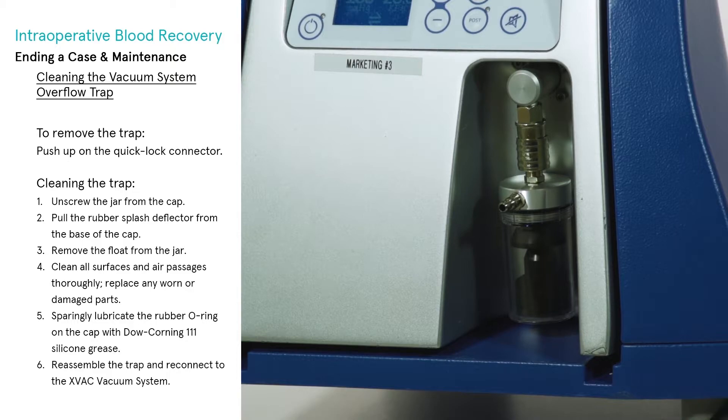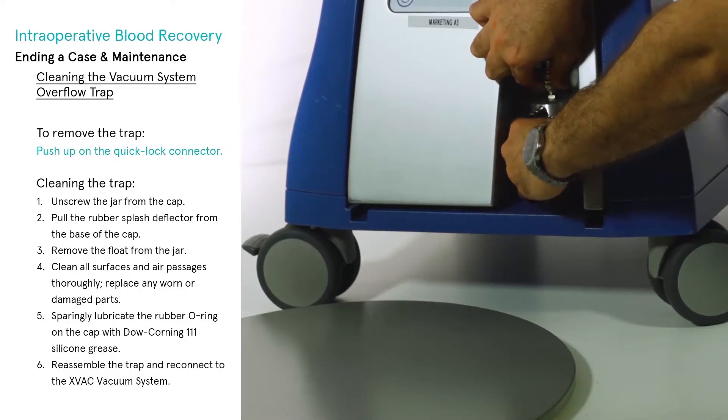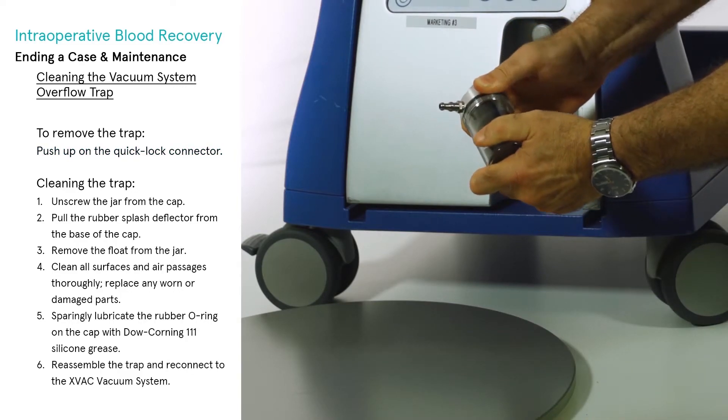Cleaning the vacuum system overflow trap: cleaning should be performed when liquid overflows into the trap or any time it is visibly dirty. The container should be checked prior to each use to ensure it is clean and dry. The trap should be removed and disassembled for cleaning. Push up on the quick lock connector to remove the trap from the vacuum system.